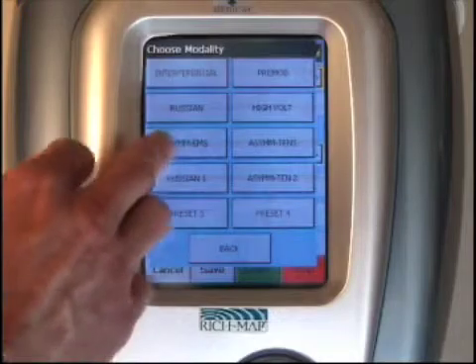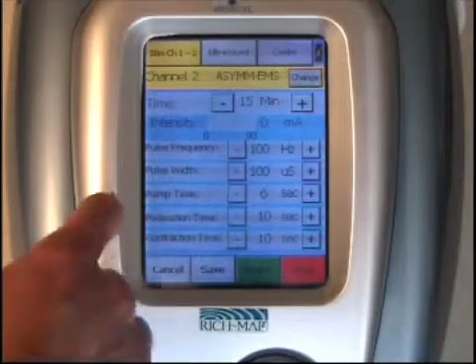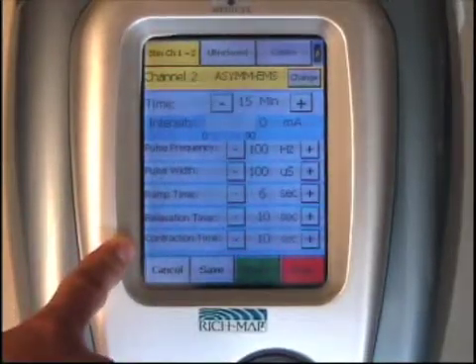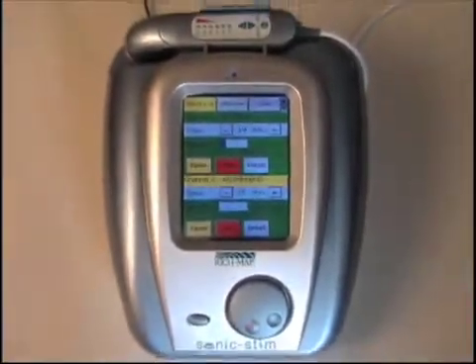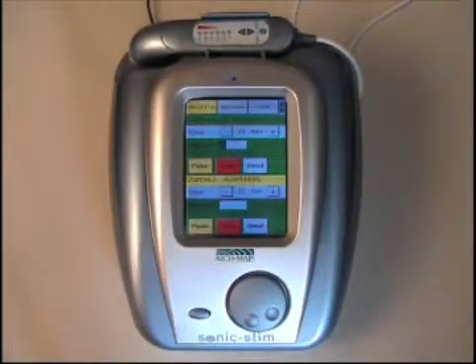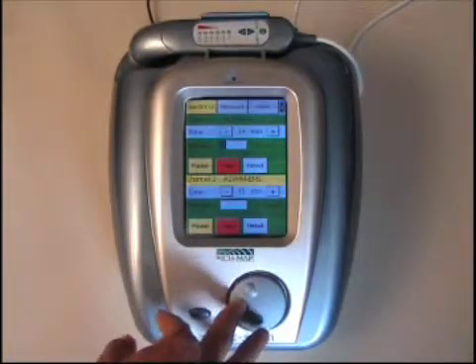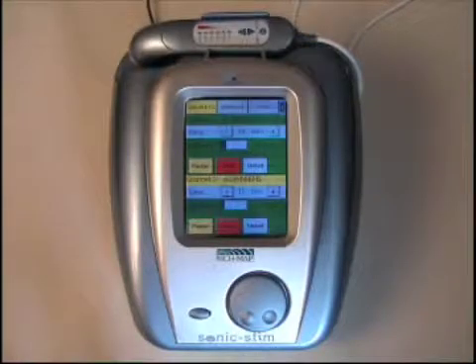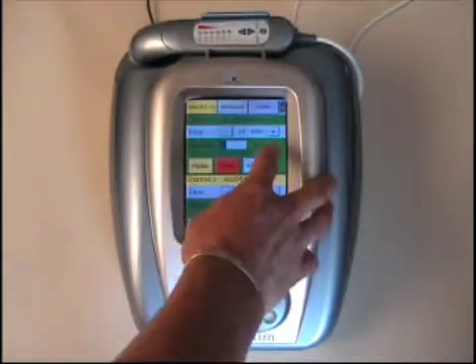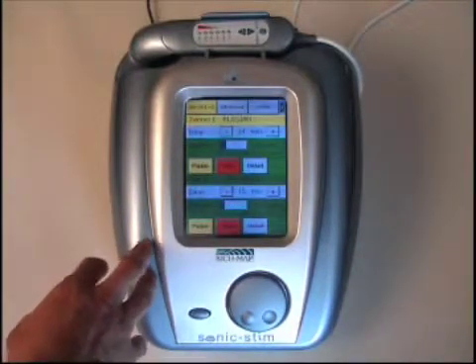We'll select asymmetrical EMS. Once you've selected that, you'll go back to the main menu where you're able to select any of the parameters that follow. Once those are selected, you simply press the start button and the unit returns to the main menu where both screens are green and live. At this point, you adjust the intensity on channel two. At any time you want to change the intensity or look at the details, you simply press the green background within each segment to highlight the channel, giving you control over each independent stem channel.